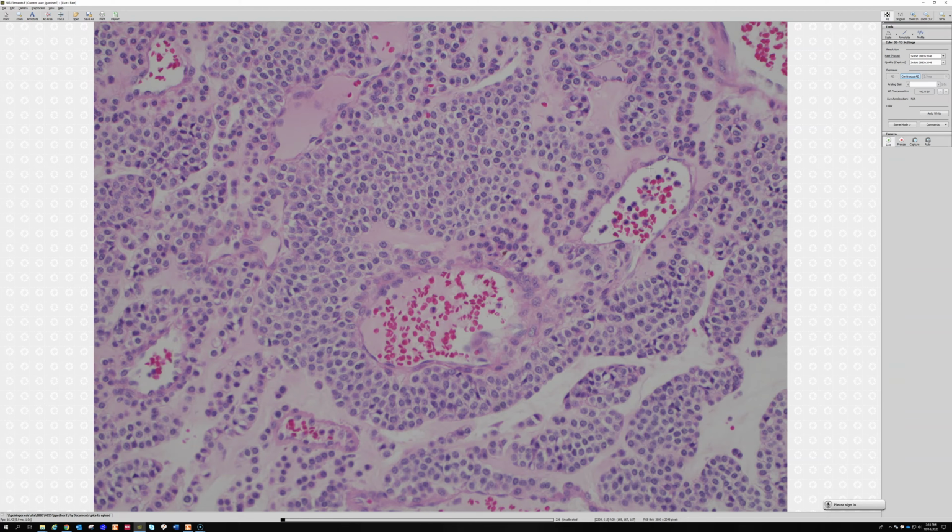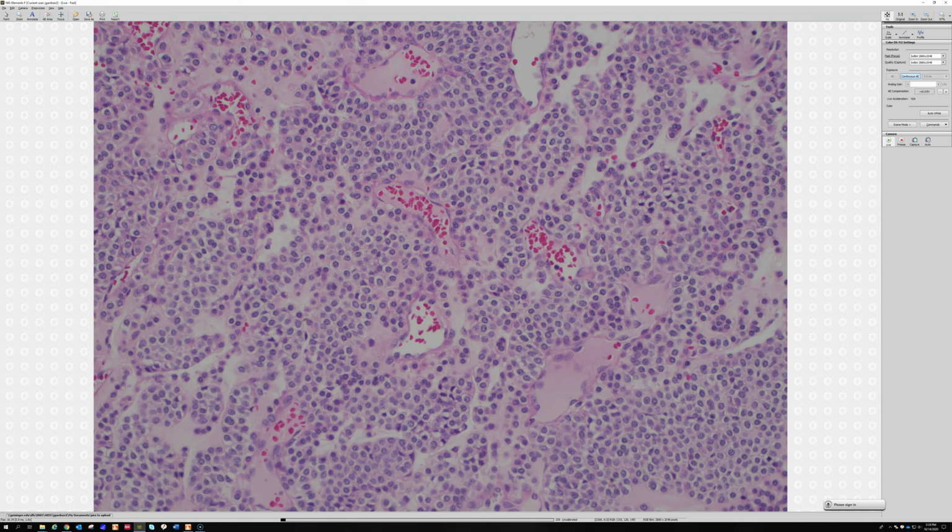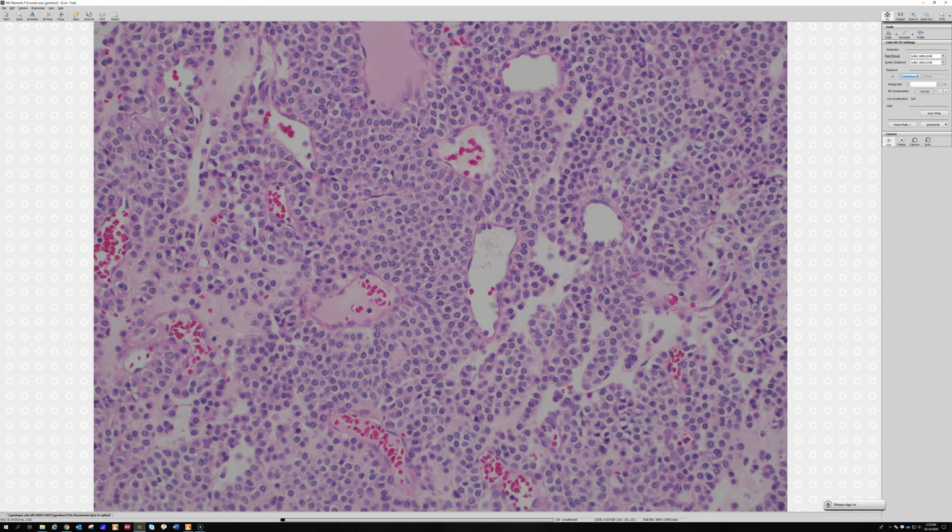But we can see glomus. Obviously, the nail bed is a good site for glomus, but you can actually see them anywhere in the body. Internally, when they involve the internal organs, the stomach seems to be, I think, the most common site, if I recall. Certainly, it's a well-described site, and it's important because think of the other tumors that occur in the wall of the stomach, things like GIST and stuff like that. So you want to make sure you don't confuse this, because the significance is different.